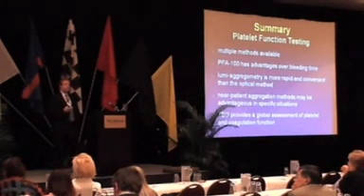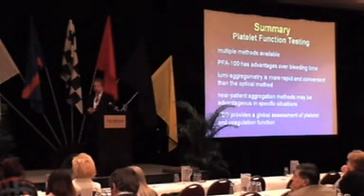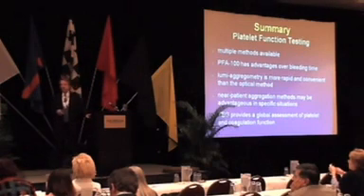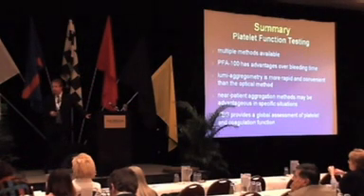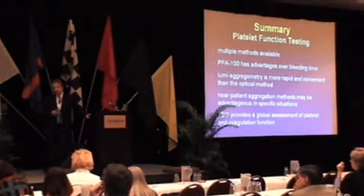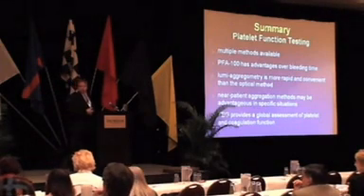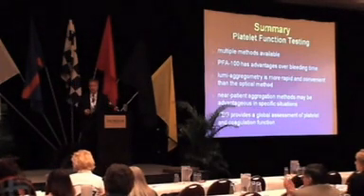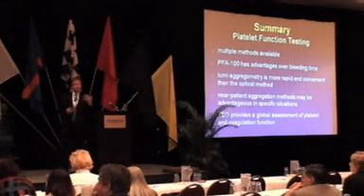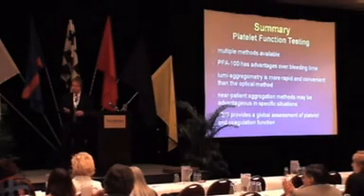We have 2 different methods of aggregometry. They both work extremely well, and all I will say is that lumi-aggregometry does have some significant advantage over optical aggregometry, but you can get the same data pretty much out of both systems. There are some new methods coming along which may well have some specific advantages for certain situations, particularly in the cardiac stat lab. But the TEG is definitely worth a look if you're not that familiar with it, and maybe think about bringing that into the clinical lab, because some of its applications, I think, are really very interesting.